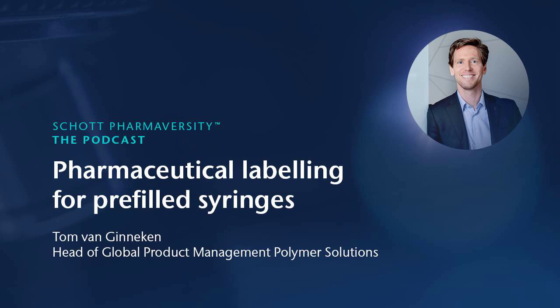Some of the things that we look into in upgrading the label, which is known for information, to functional labels is to reduce the oxygen permeation, so increase barrier properties. It could also be a UV protection system. You can also add tamper evidence features. And the last topic that we look into is also to help automate inventory management in hospitals via RFID technology. So those are some of the things that we looked into.